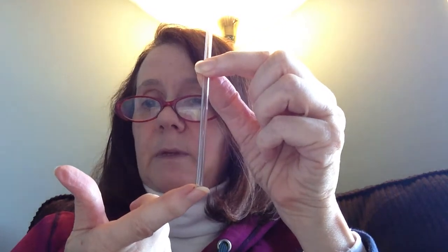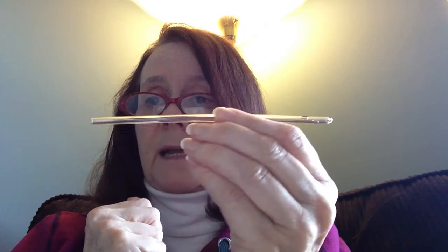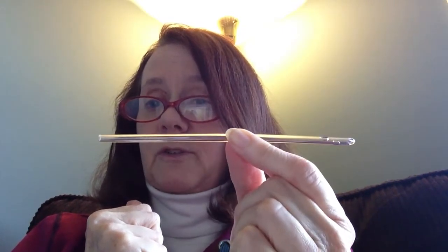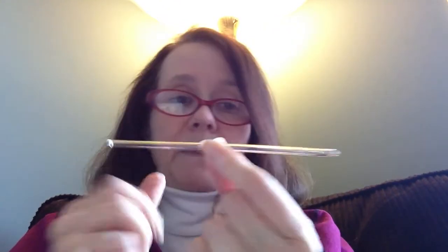So you slide this in, and again, this is the end that's coming out that's draining into your collection container or your toilet. So that's the kind of catheters that you should be using, or your doctor's office should be using. So if you're new to this, I just thought this might be a good little how-to lesson, because I see a lot of postings about this, and I thought maybe a few people would like to see what it is that I'm trying to describe when I write about this online. It's a little more difficult to imagine.